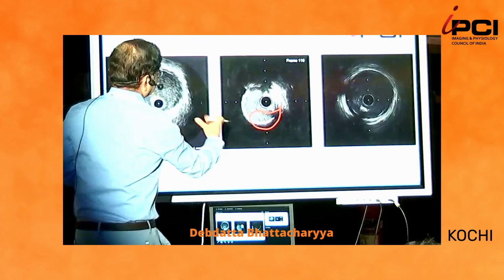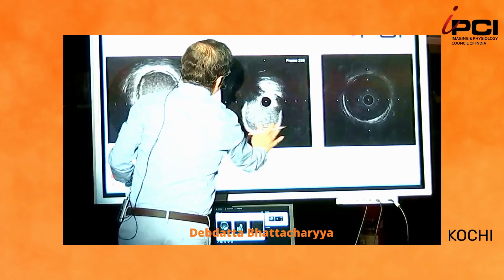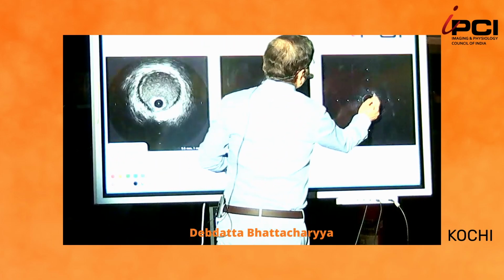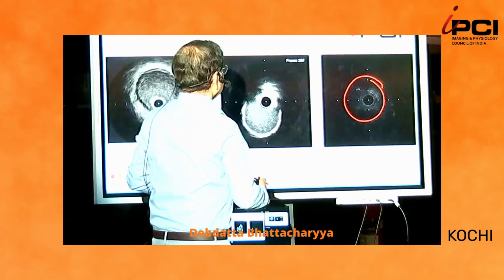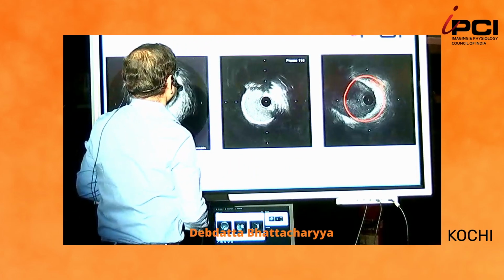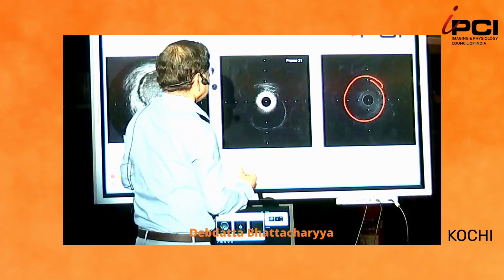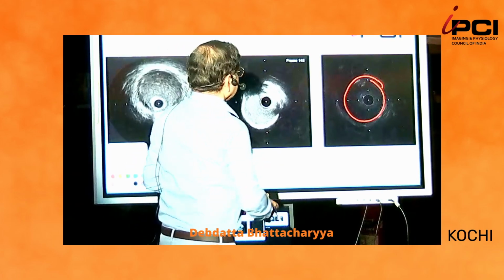And then as I give a flush, the blood speckle comes back. But on this one, you are flushing, you can't see, you are flushing, but it does not clear up adequately. In those cases, you have to take the catheter out, flush, and then go back again. See, as you go up, it again becomes dark.